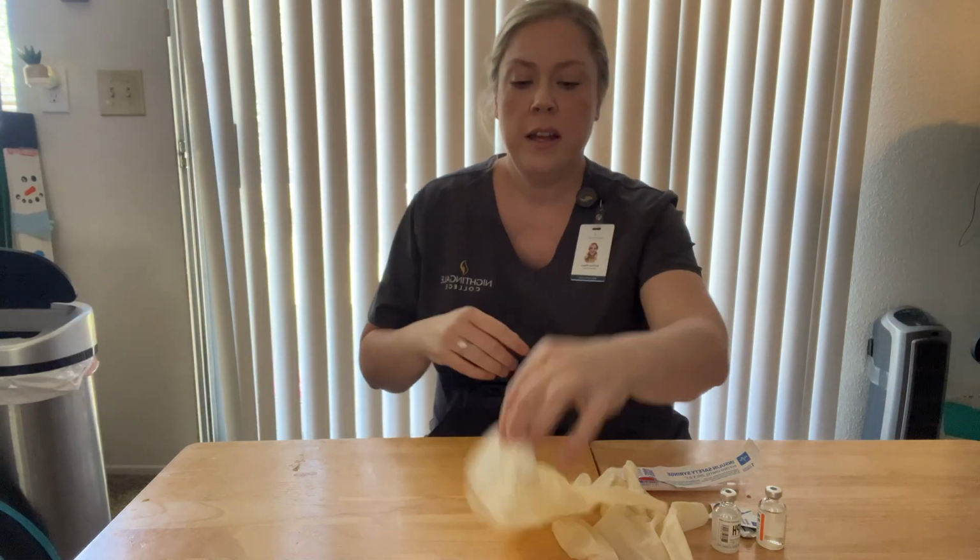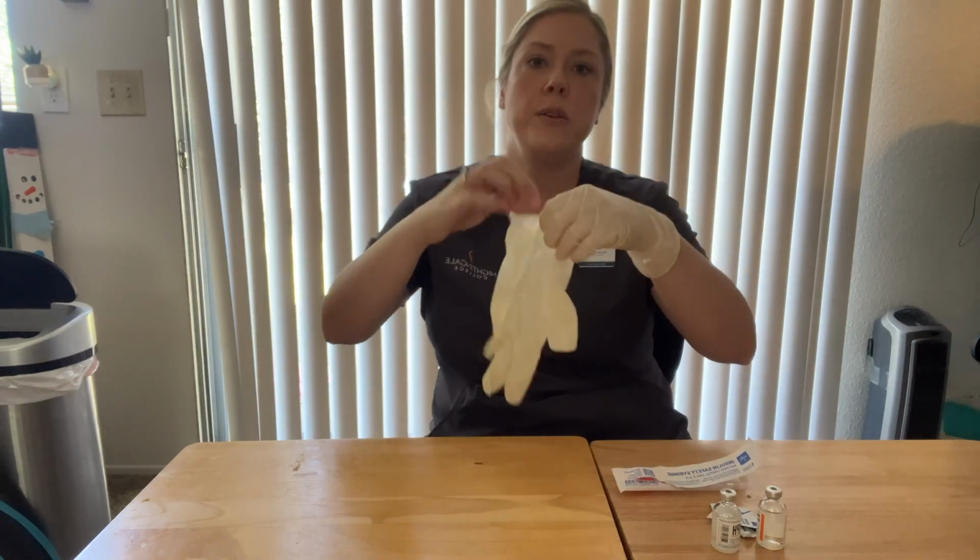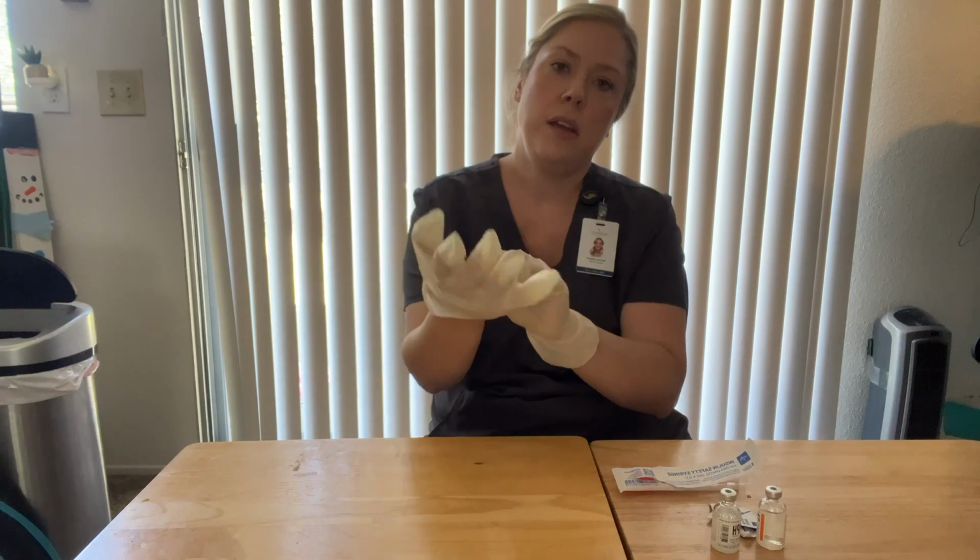Perfect. So today the doctor did order some insulin. I will go over more in detail before I do administration. I would go ahead and start hand hygiene and apply a pair of clean gloves. So Mr. Smith, the doctor did order 4 units of regular insulin and 8 units of an intermediate acting insulin.